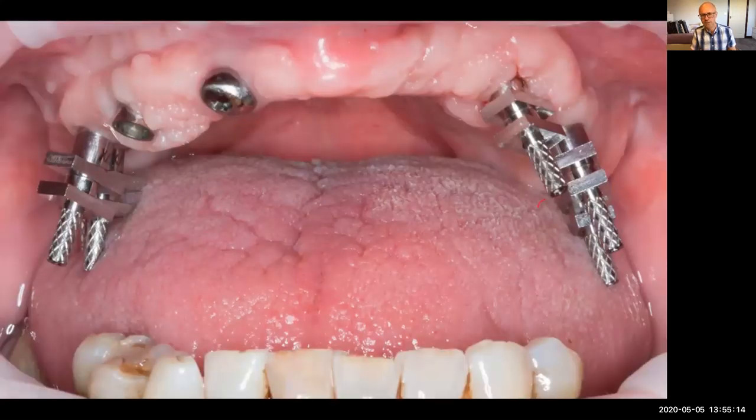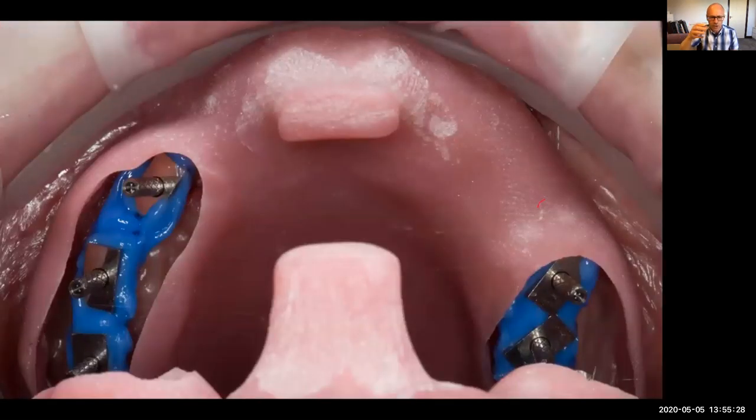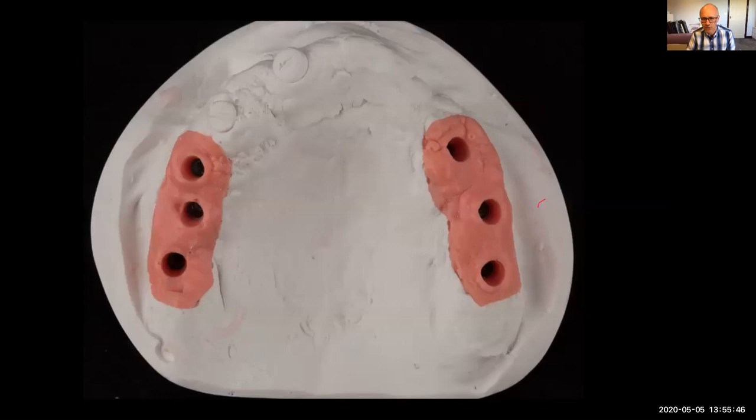So we then go to a definitive impression with all of these abutments in place. So we put our fixtures. These are the impression abutments. They go onto the fixtures themselves. I link those together with Luxabite and floss. I then do an impression in that open special tray with Imprigum, just like a denture, complete denture style impression. And that gives us a soft tissue model.